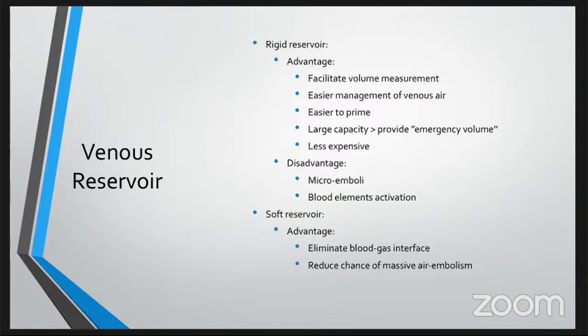The soft or closed reservoir is expensive, but it eliminates the blood-gas interface and reduces the chance of massive air embolism.